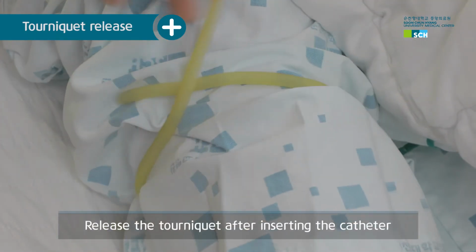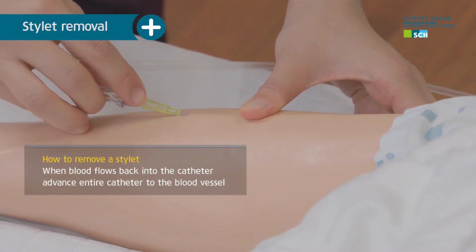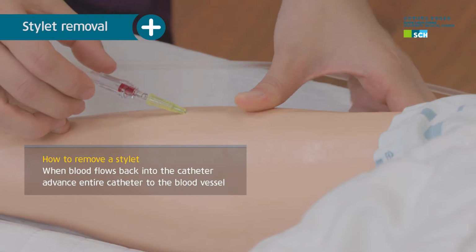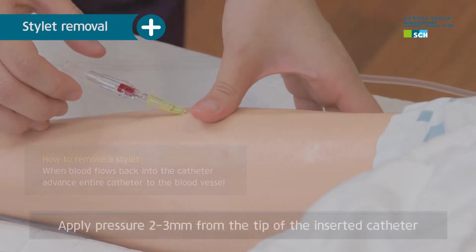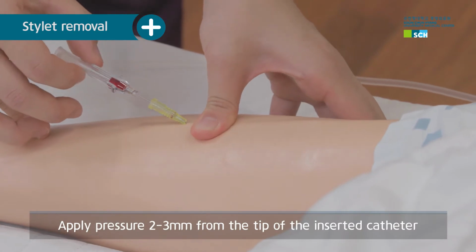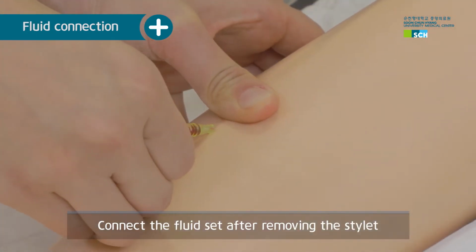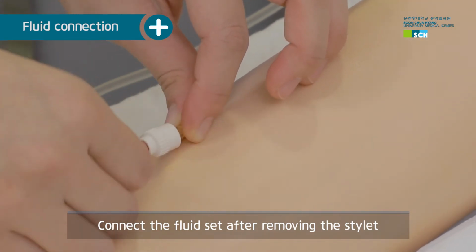Release the tourniquet. When blood flows back into the catheter, advance entire catheter lowering the insertion angle. Remove the stylet while gently applying pressure 2 to 3 millimeters from the tip of the inserted catheter with the other hand. Connect the prepared fluid set aseptically to the IV catheter.